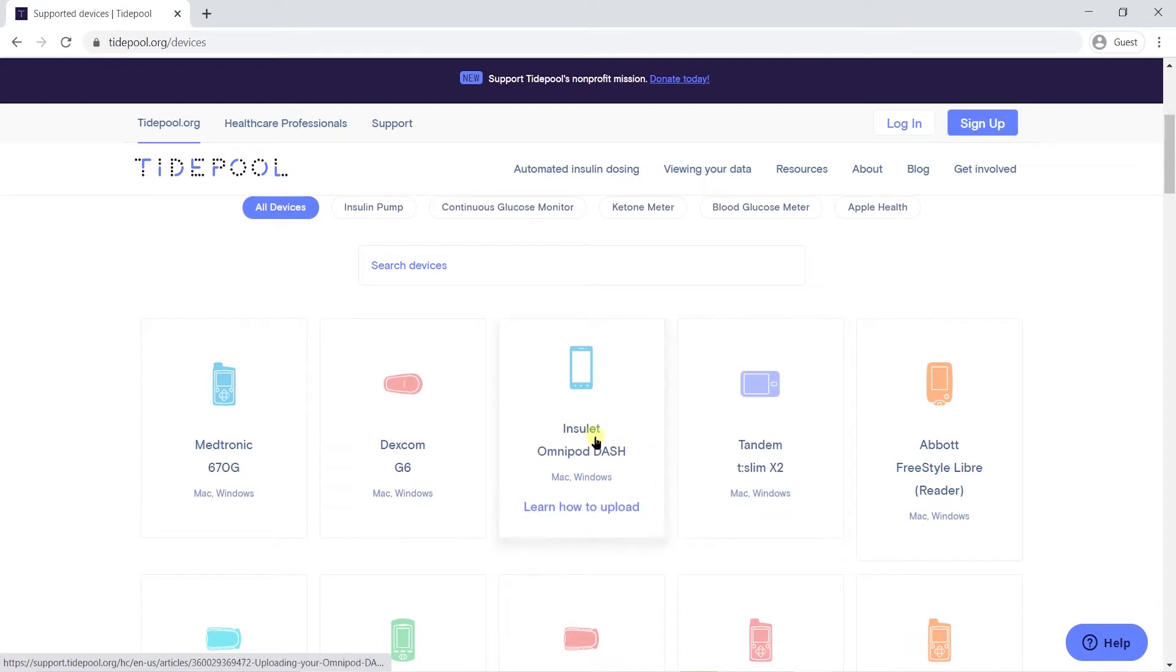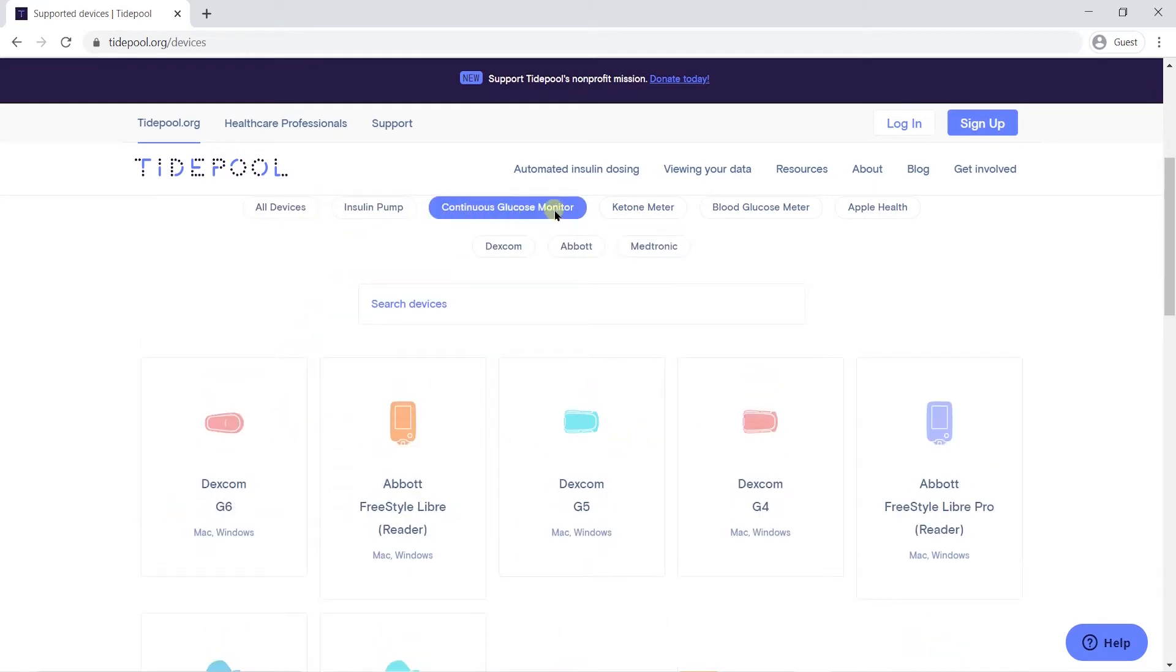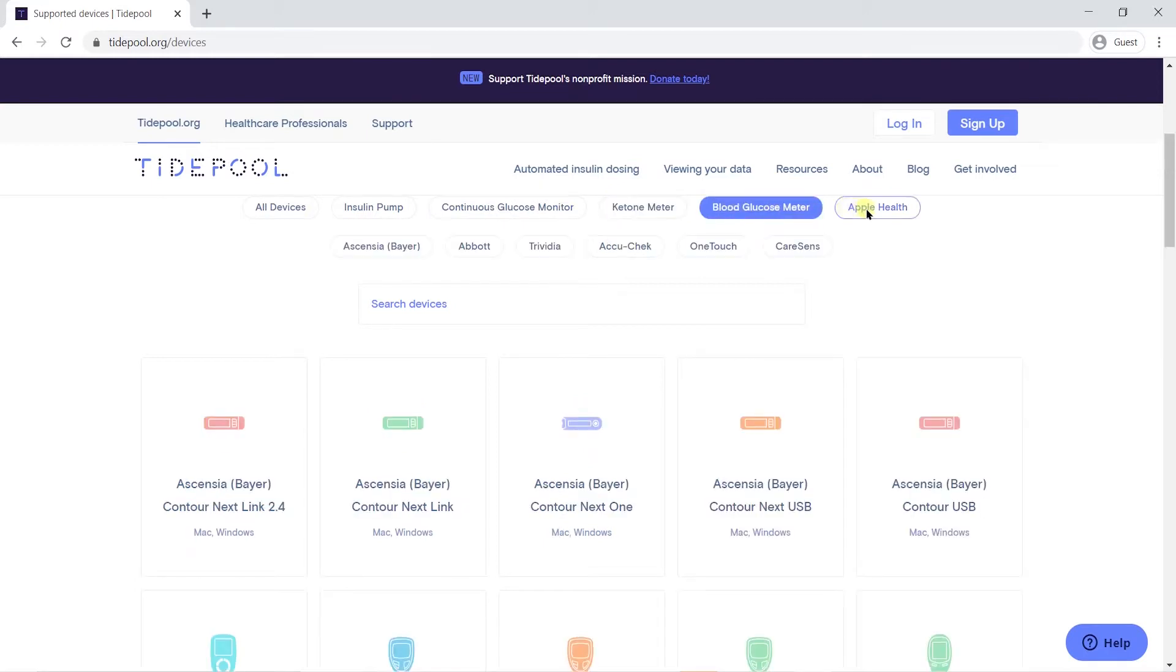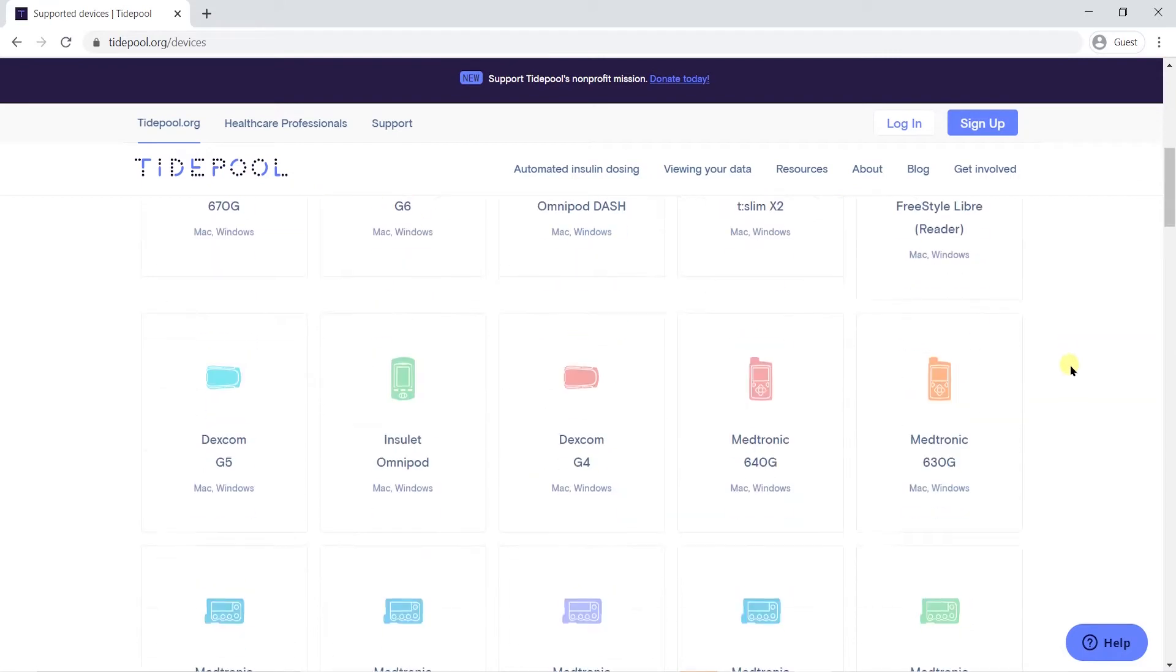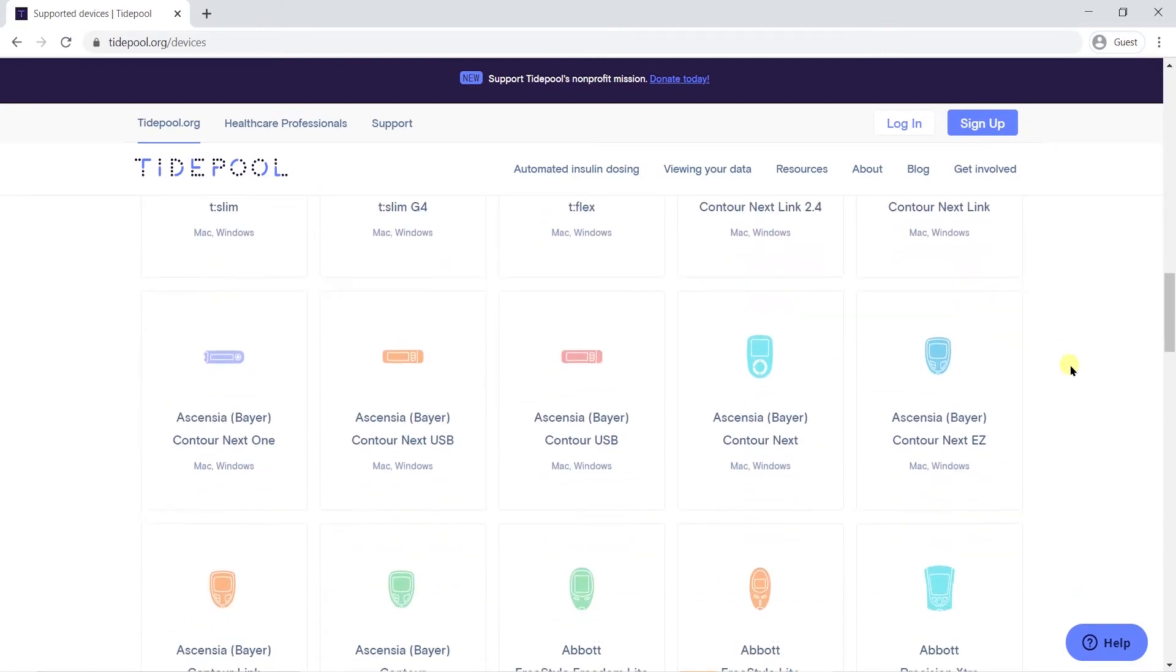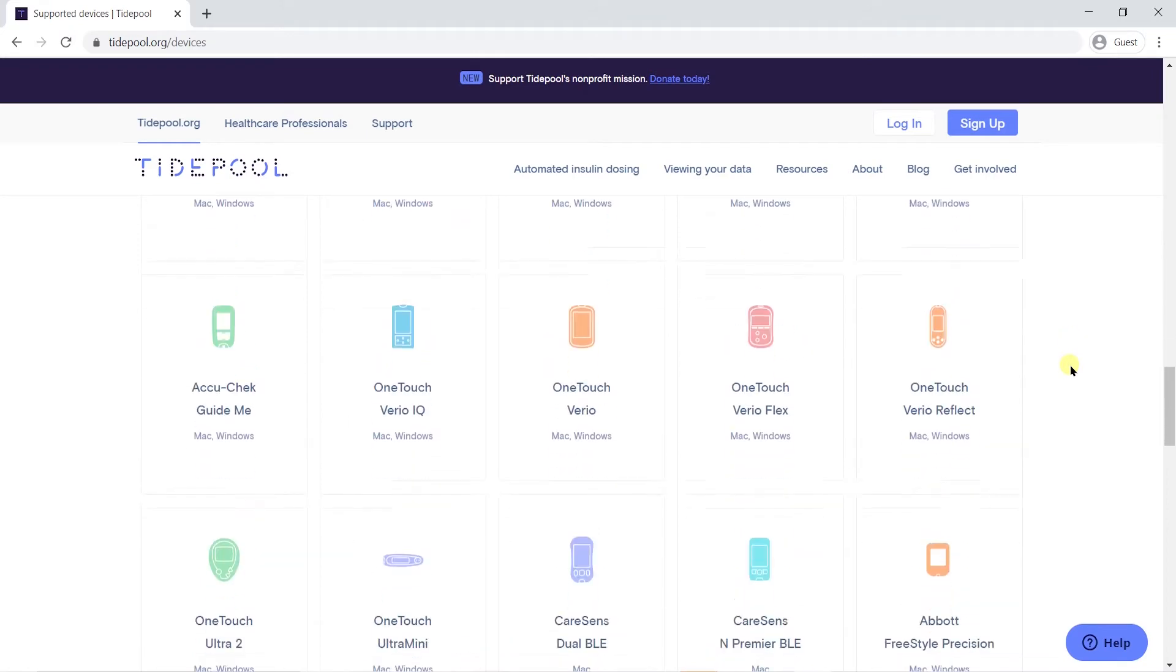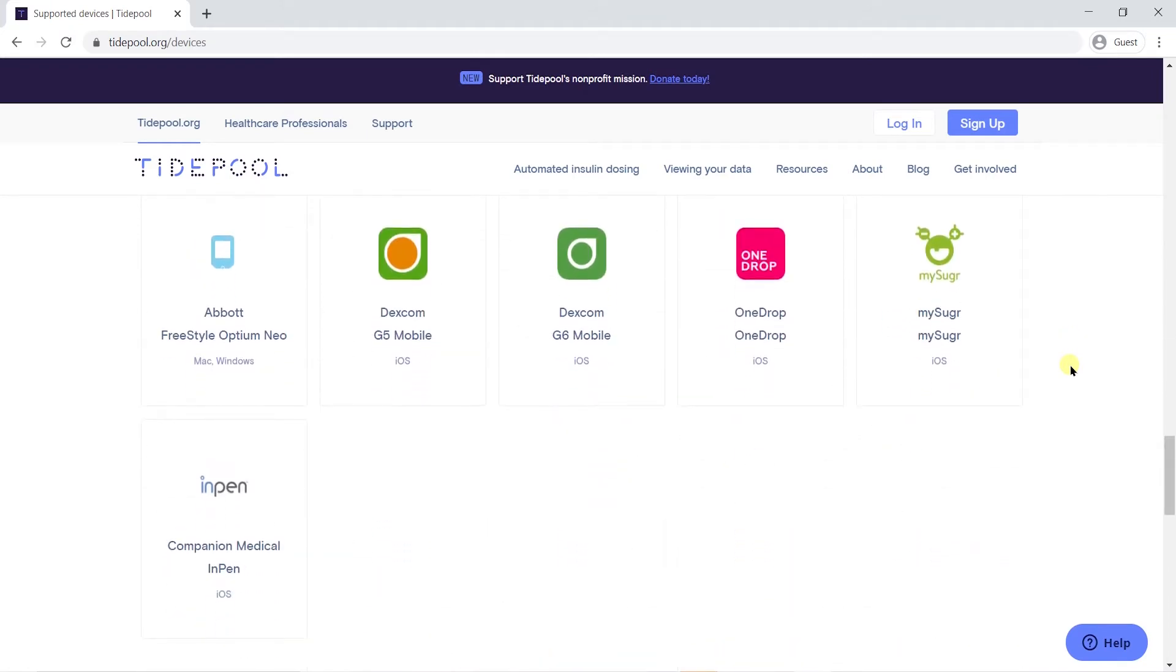Our free software allows you to upload data from over 50 supported devices, including every brand of insulin pump and continuous glucose monitor, or CGM, on the US market, and a wide variety of blood glucose meters and diabetes apps. You can see our full list of supported devices at tidepool.org slash devices.